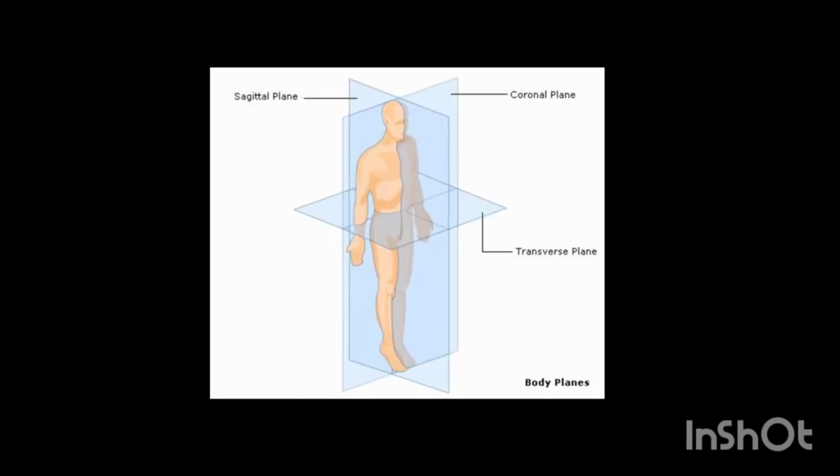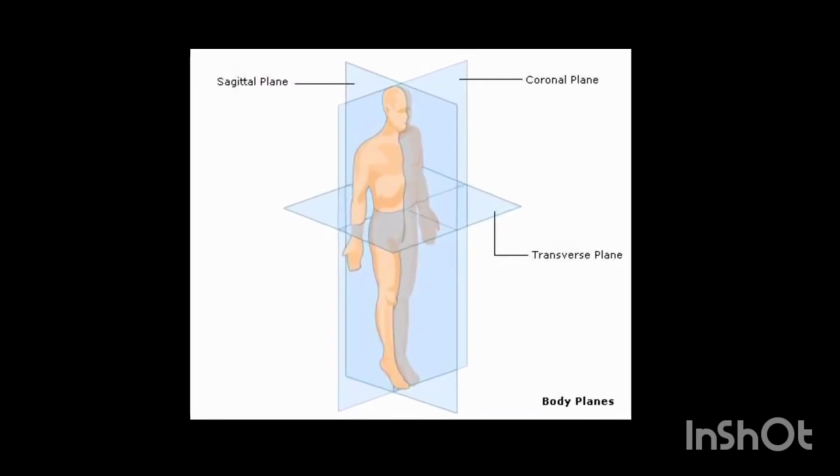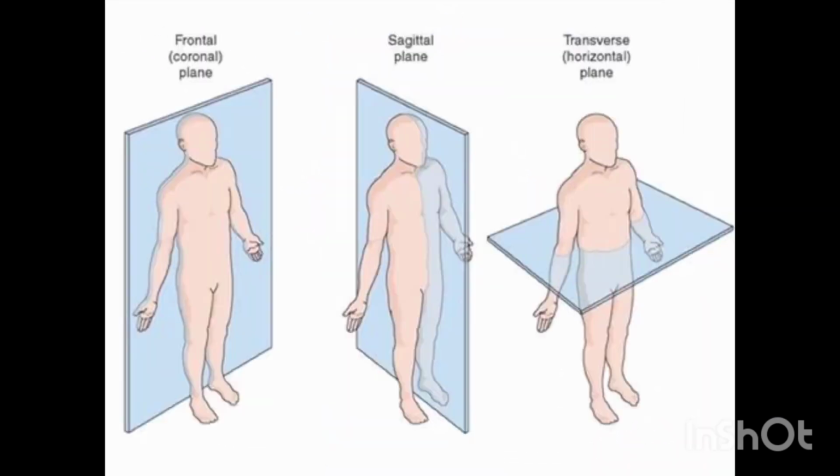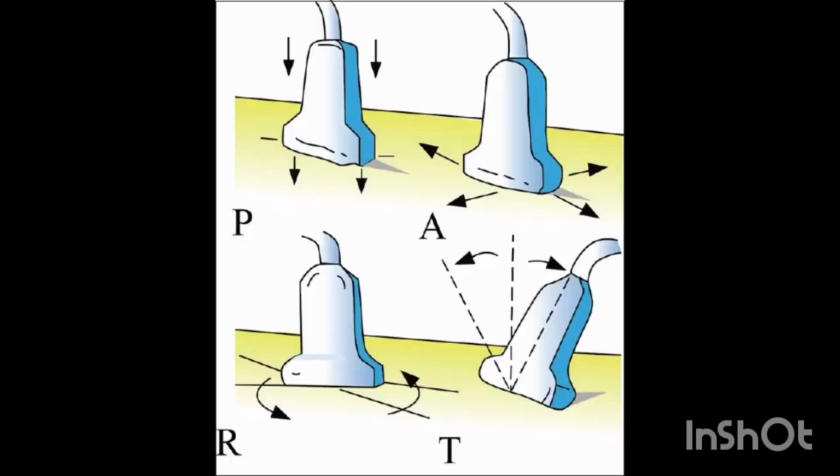There are three standard described scan planes: body planes, coronal, sagittal, and transverse. The beginner is generally advised to stay in these simple planes so as to be able to reliably obtain recognizable images repeatedly. This is what makes focused scanning feasible. With experience, changes in the inclination of planes help to obtain improved images.